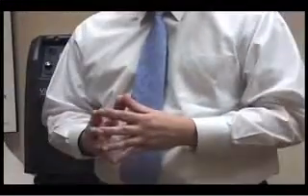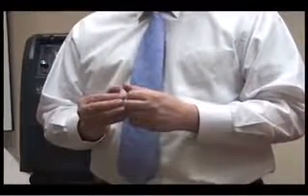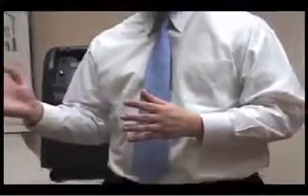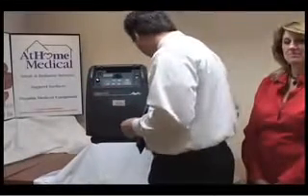The oxygen concentrator works by taking air out of the atmosphere and separating the oxygen from the nitrogen. It then filters out the nitrogen and leaves oxygen in your concentrator. That oxygen is delivered through your machine and into a nasal cannula.